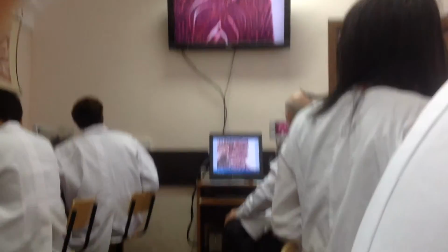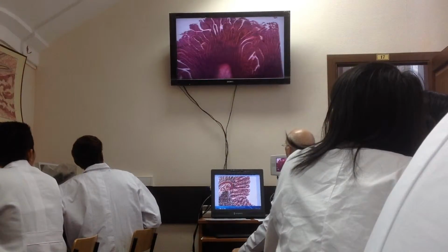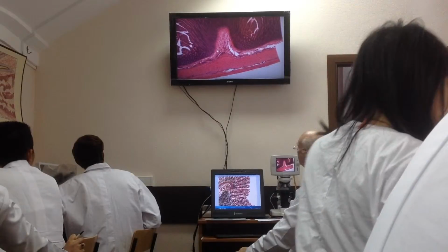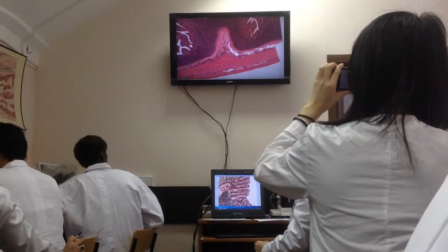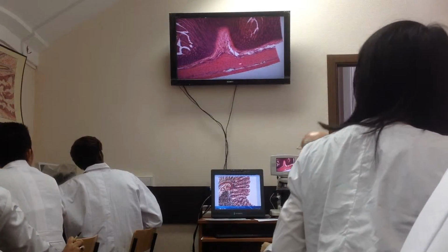What organ is demonstrated here? Pay attention, plica. See? Plica, evagination of submucosal layer. See? In this organ, plica present. Plica is submucosa plus mucosa.